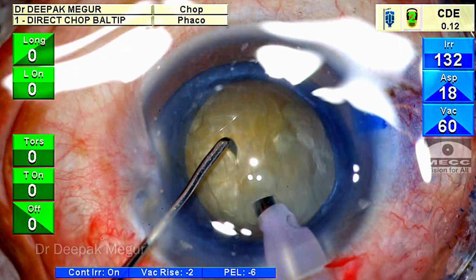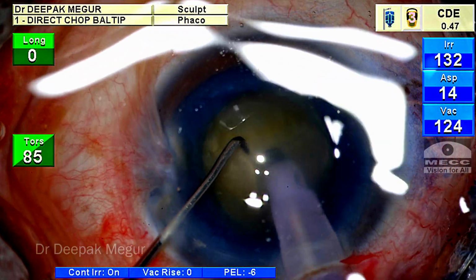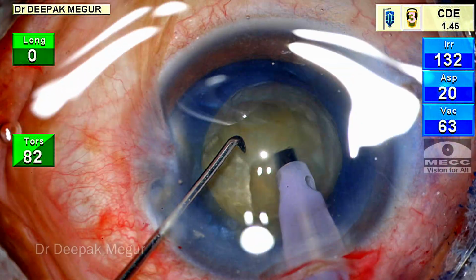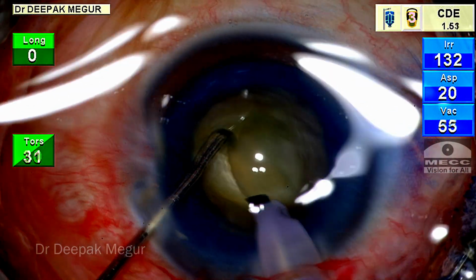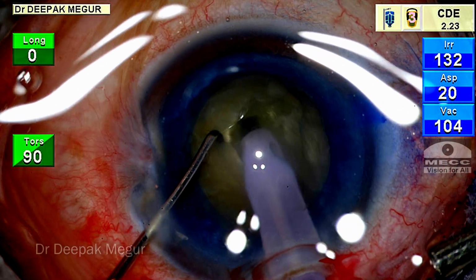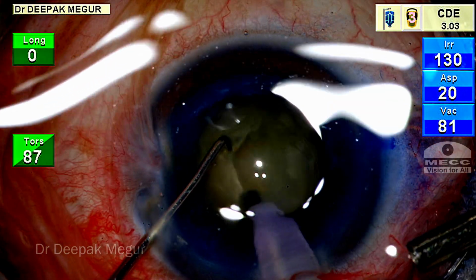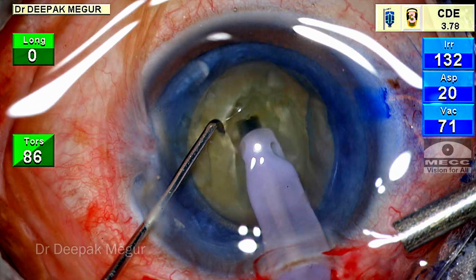So the plan is to do a trench and then chop. So I'm going to begin my trenching. I'm using continuous torsional energy to do the trenching. I just create a central pit which gives me enough space and allows me access to the central core of the nucleus so that I can bury my phaco tip deep into it and then do my vertical chopping.